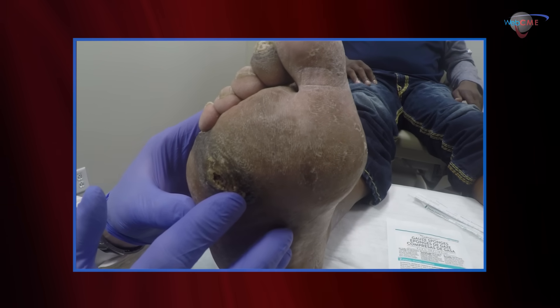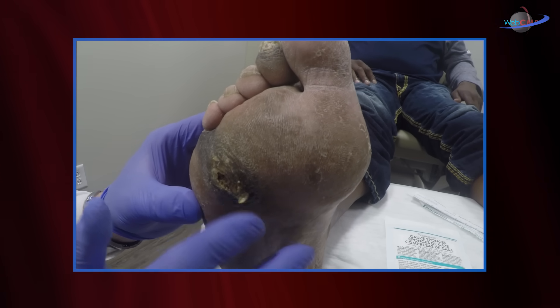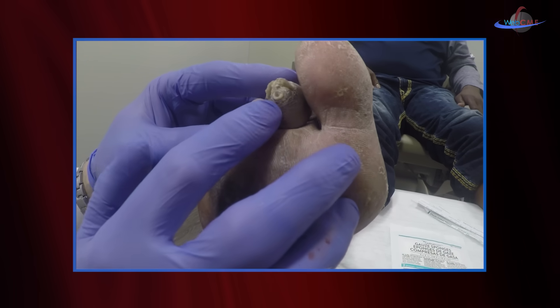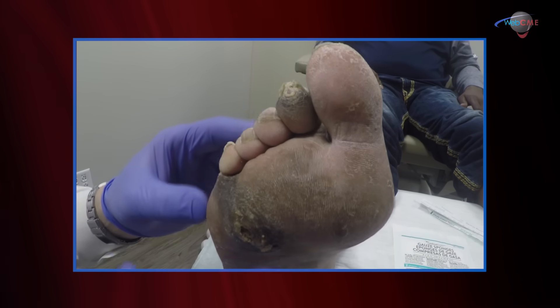The callus can hemorrhage, it can form ulcers, and this certainly needs to be debrided. Notice that there's another area of callus formation here on the distal toe — callus formation can be in multiple areas of the foot. This is typically debrided.